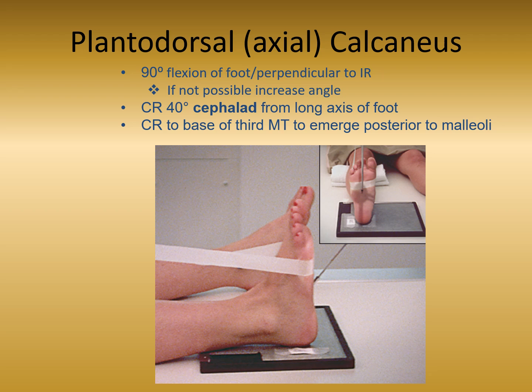This is the way that I always did my calcaneus. I always did the planto-dorsal, where the patient would sit on the table, put their leg all the way out, place their foot on the IR, and I would have them stretch their foot back. Here you can see they've placed some tape around the foot, and the patient can pull their foot back for you so that we don't have the metatarsals, or the digits for that matter, superimposing into that talocalcaneal joint, which is what we're looking for.